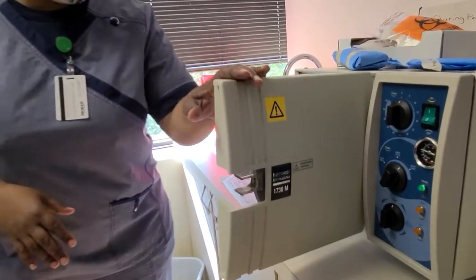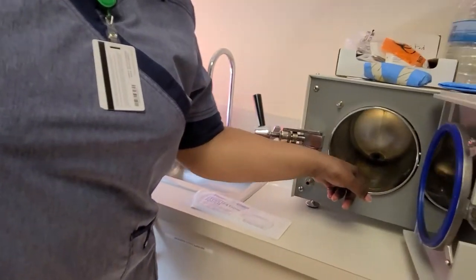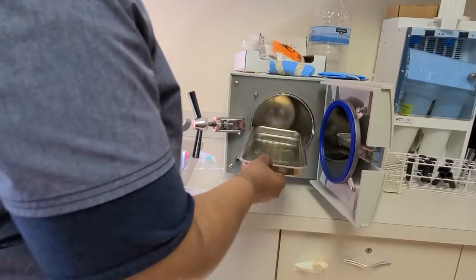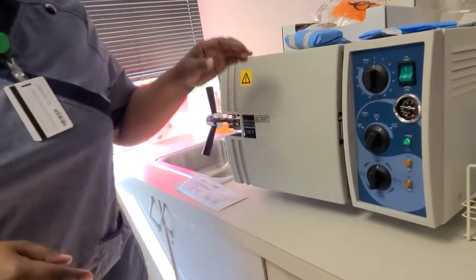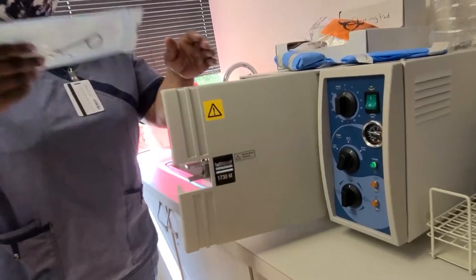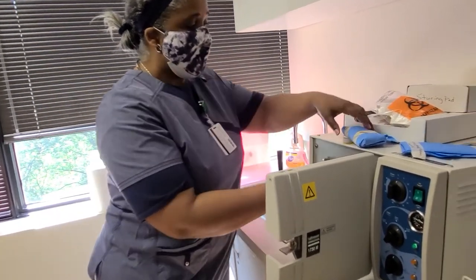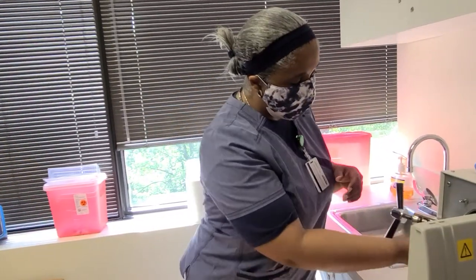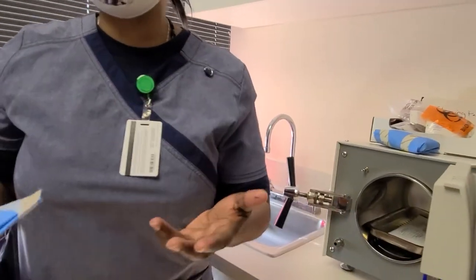Once I do that, I'm going to stop when that water gets right here to this little divot. That's your stop line, okay? There's a little divot here, all right? So after the water gets there, I'm going to place my instruments face down. Remember, the plastic is going to be face down. When I'm placing these type of instruments in a muslin wrap, I like to place it not exactly on top of it, but kind of away. And you can put a lot of things in here.